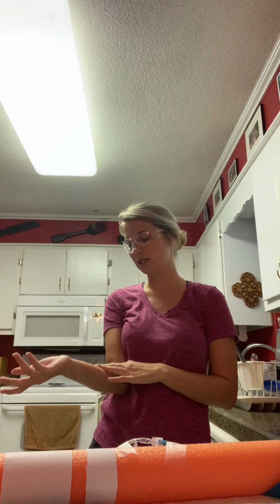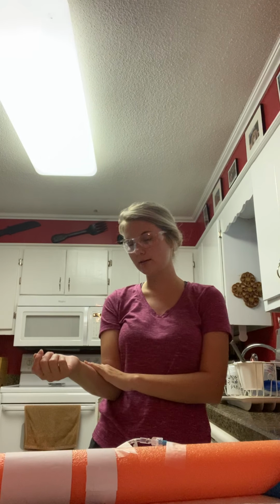You would want the patient to observe for if there was any blood coming out around the needle. You would want them to keep the IV covered whenever showering, and you would ask them to not use this arm as much as possible. You would lower the bed, raise the side rail, position the patient for comfort, make sure the patient had all the necessities, make sure the patient had the call light.